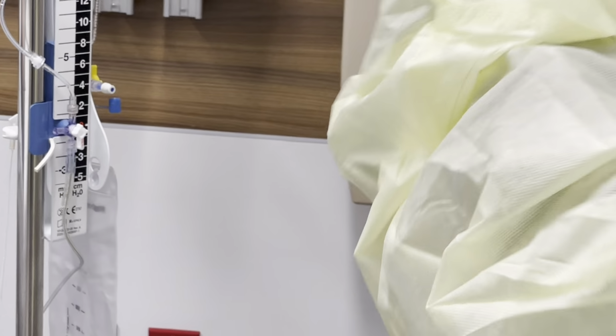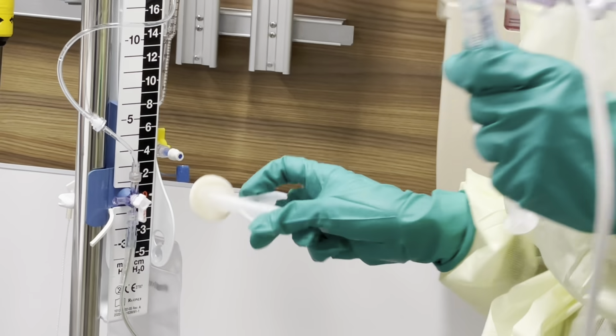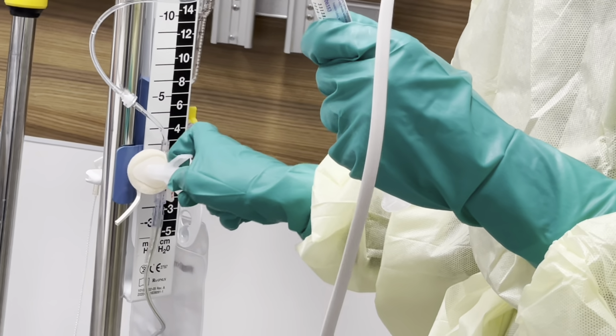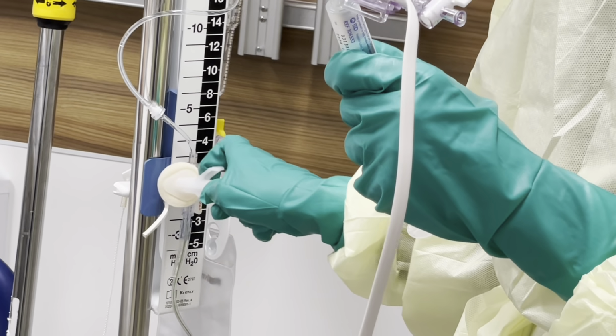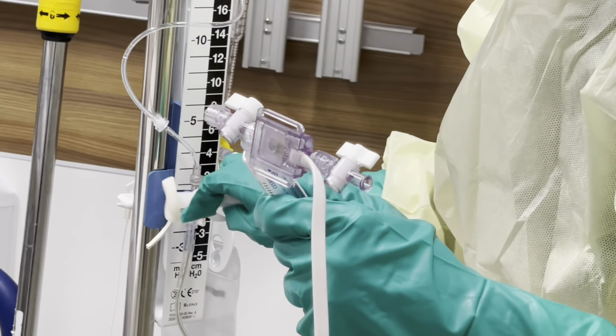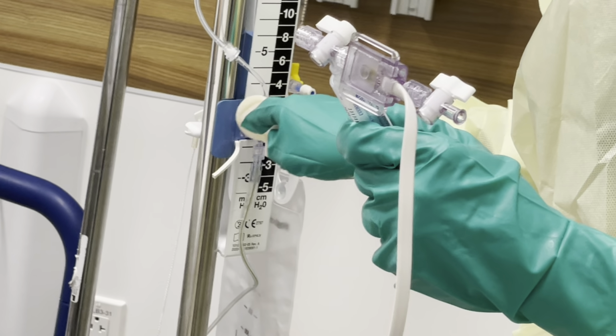We are once again gonna take a brand new clean, sterile CHG, and we're gonna scrub the insertion site here. Scrub this little hub over here, because now we're gonna add our transducer to it, and we want to make sure that anything that's coming up over here is nice and clean, okay? We don't want any reason, again, that any bacteria is gonna get in there.